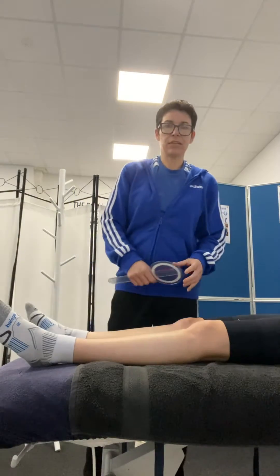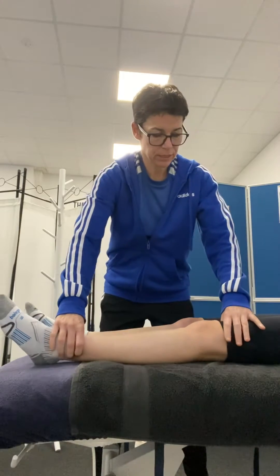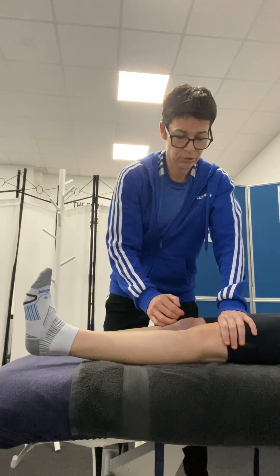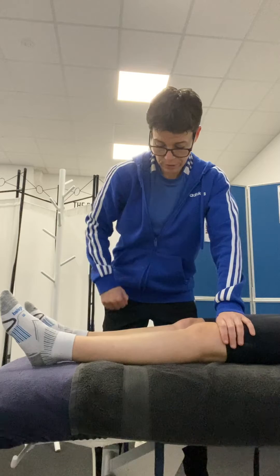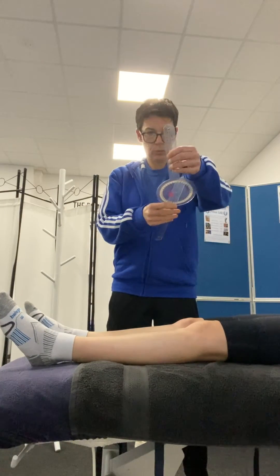I'm going to be measuring knee extension. There are two different ways to do it. The first one is to get the client to try and lift their heel off the couch, making sure their knee stays on the couch, and just relax. We can measure in centimetres how far the heel comes off, using a goniometer which has centimetres on it, or a tape measure.